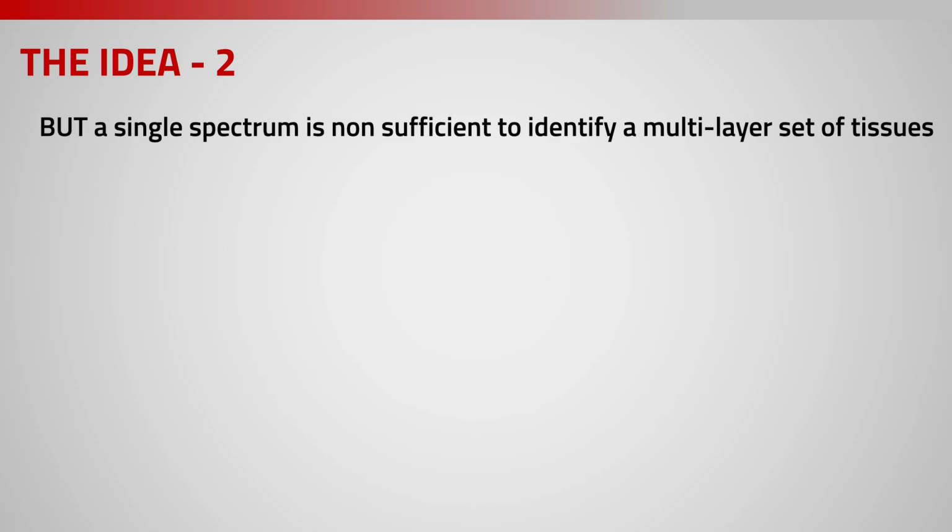Obviously, in impedance spectroscopy, a sinusoidal stimulus is applied, and then the effect in terms of difference of potential is recorded. A further idea is that we have to deconvolve the response to the electrical stimulus from a complex multi-layer tissue. So we need further measurements.